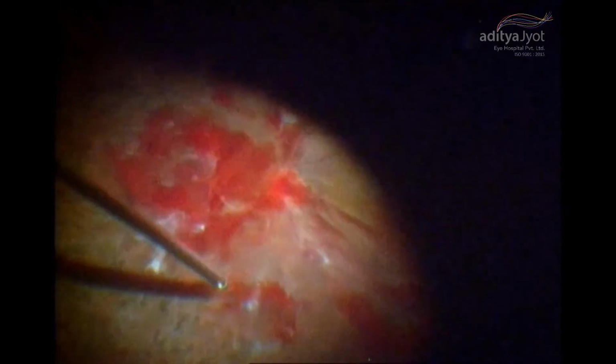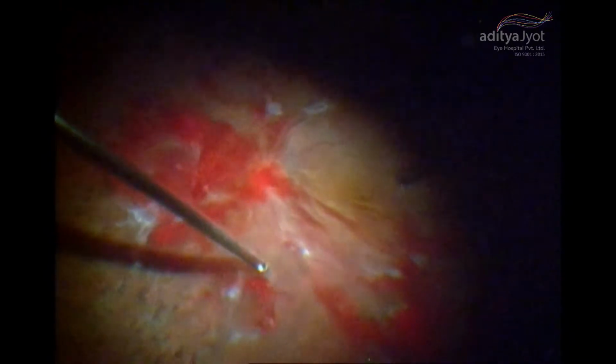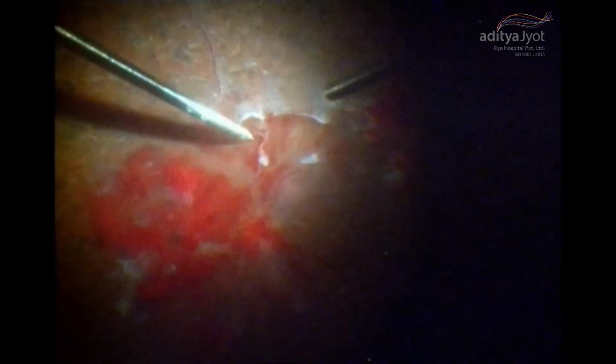You can slowly see that most of the traction is being removed, using the cutter, alternatively using the suction, and using bipolar diathermy to make sure that further bleeding does not happen. And you can see there was an existing round hole along the traction which has been identified, and now you'll do endo laser around that. And here, along with the fibrous tissue, the blood clot is also being removed.